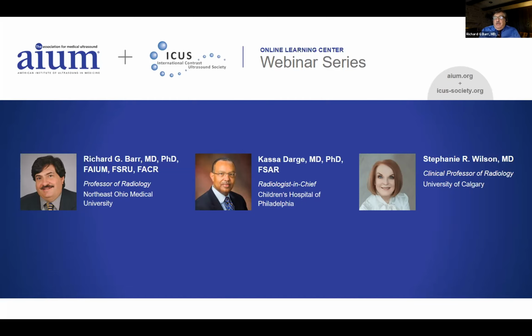This way they were able to do it in the intensive care unit and not have to go down to get a CT with contrast, which I thought was a very interesting application. But obviously you have to have the consolidation to be able to visualize this. There is no doubt that COVID has made a new application for ultrasound of the lung.